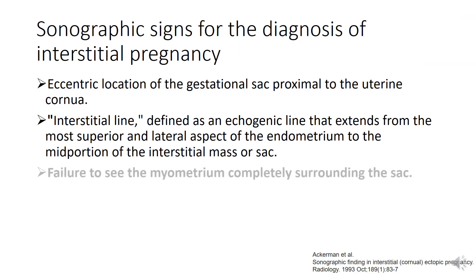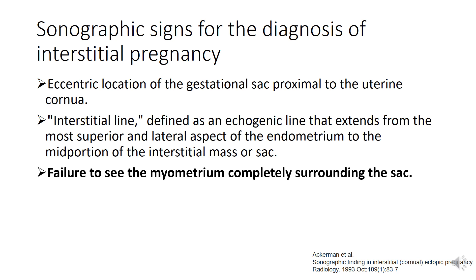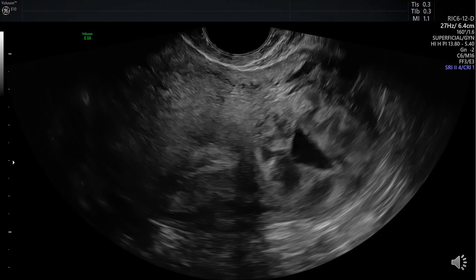The next feature is the failure to see the myometrium completely surrounding the sac. A normal intrauterine pregnancy would be surrounded by the myometrial cavity. On this picture, we can appreciate the absence of the myometrial lining on the superior lateral aspect of the pregnancy, delineated by the blue arrows.